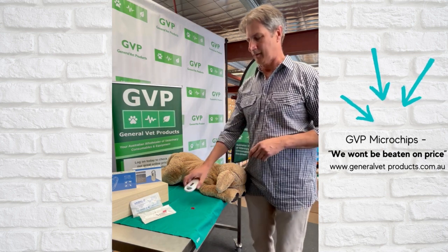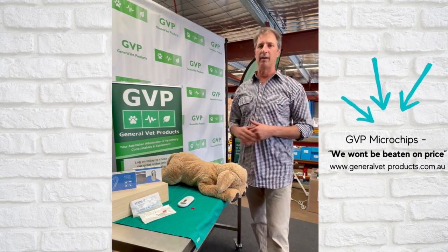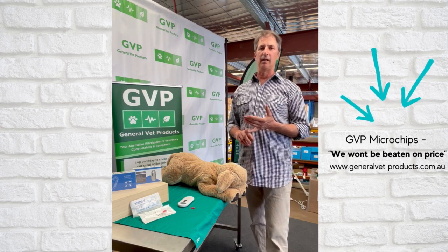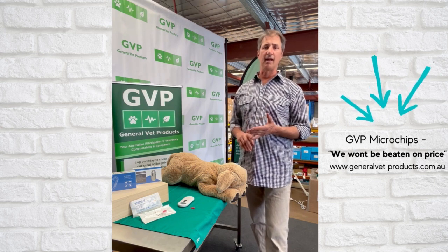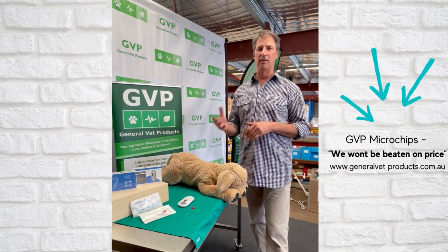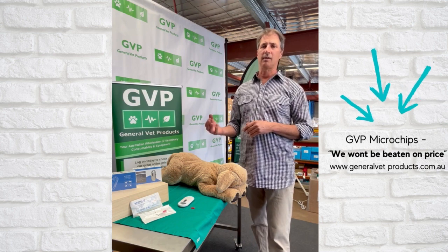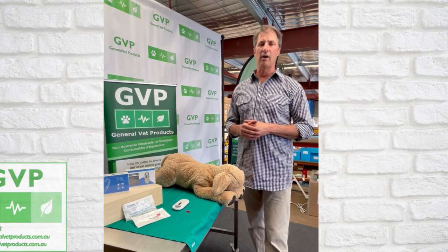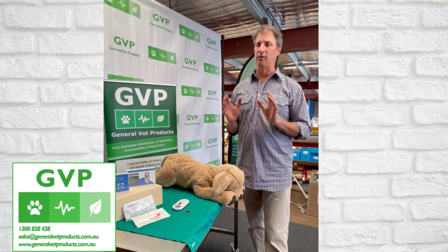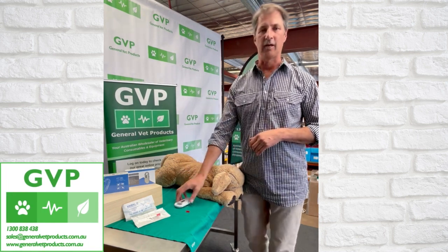That's our little microchip scanner — call us about it, it's on the website and really well priced. Everyone thinks it's great value. Our microchips are exceptionally priced — no one will beat us on pricing. For those in states other than New South Wales, we do CAR and AAR registration. Most people are doing that online these days, but you can still do paper registration. Online is much easier. So if you're not using our microchips or scanner, you should inquire — have a look on the website and check out our pricing. We sell tens of thousands of microchips and hundreds of these little scanners every year.